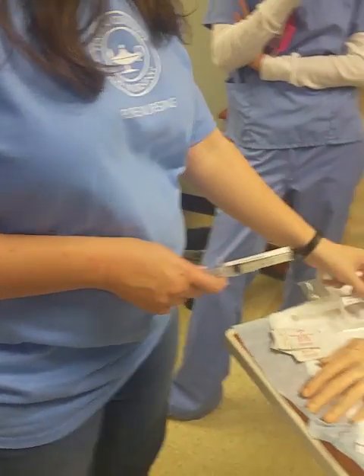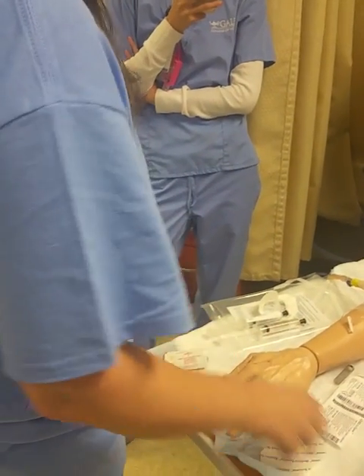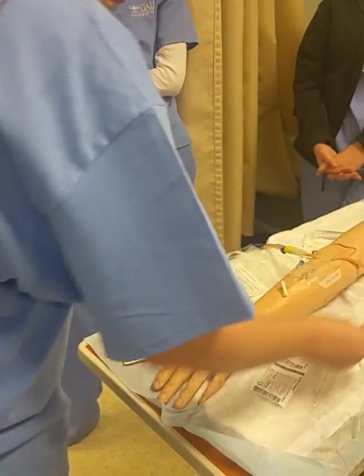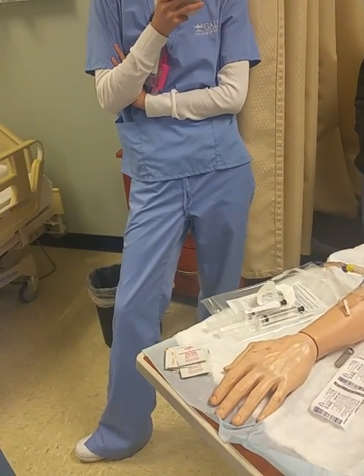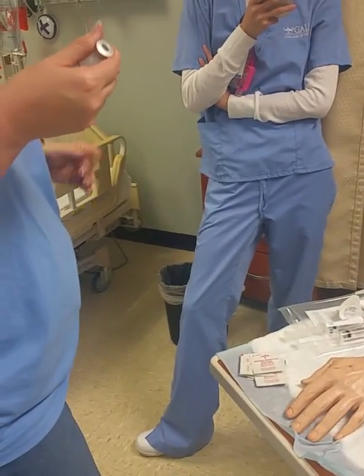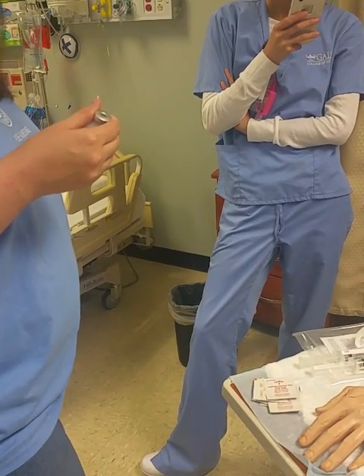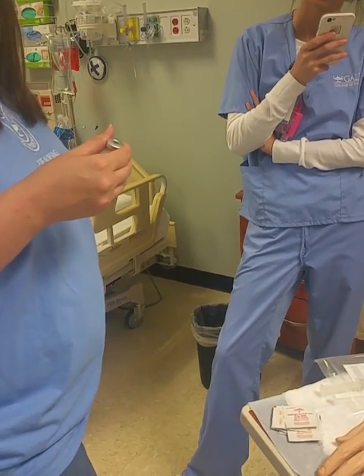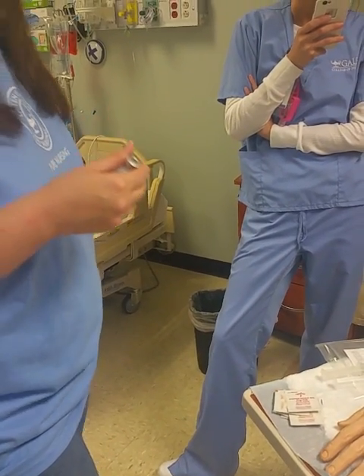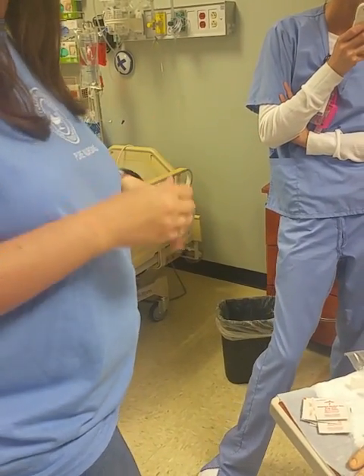So for this patient, we're going to give Lasix. The order reads Lasix 40 milligrams IV push, BID. So I'm going to look at my vial and go, okay, I have Lasix, but it only has 20 milligrams per milliliter. How many milliliters do I need? 2. The order's for 40. I have 20, so I need 2.